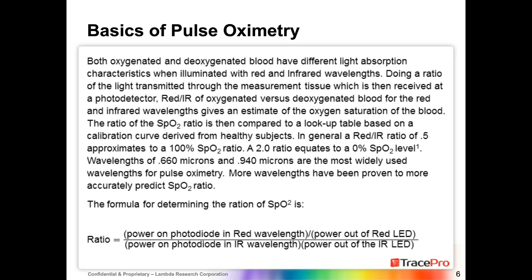So if you look at that ratio, that pretty much gives us a good idea what the SpO2 is when we're measuring and using two LEDs in the transmission method.